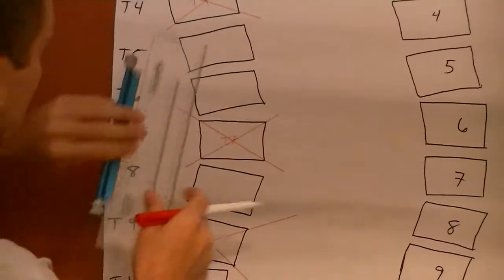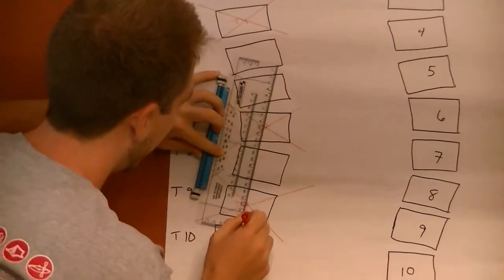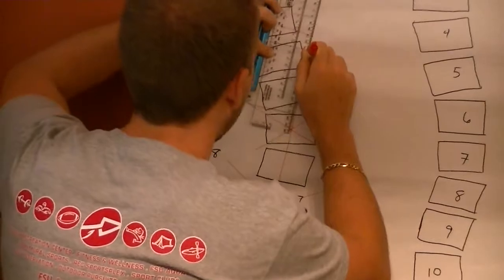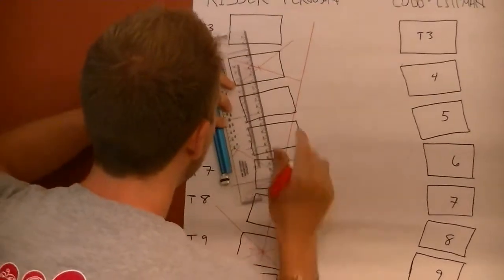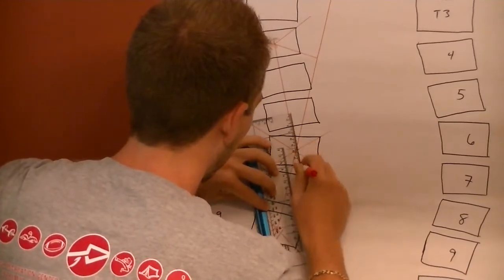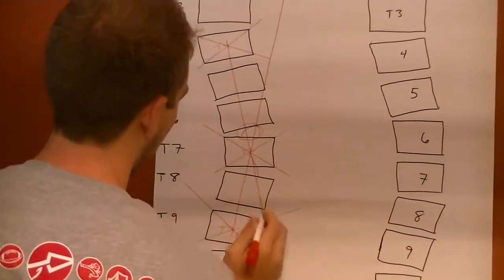This is a very big ruler here, but we want to draw through the two bottom center points. On T9 and T7, draw a straight line going all the way through. I'll just do it like so. Then through T4 and T7, do the same thing. This right here is the angle that you would want to measure, or this angle.